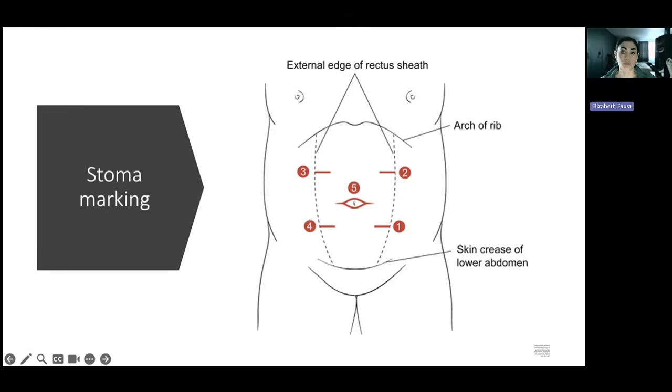And what I do during the stoma site marking procedure is I gather up my items, which is like a marking pen or a surgical marker, transparent film dressing, and we explain the stoma siting procedure to the patient. We encourage their participation and feedback. I also typically bring a pouch with me so that they can see where it would be, just to make sure they don't think they can see it and then maybe they can't.